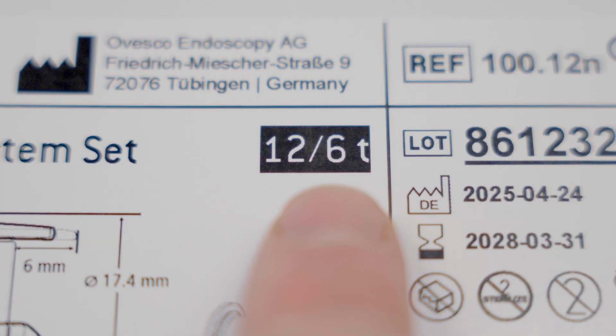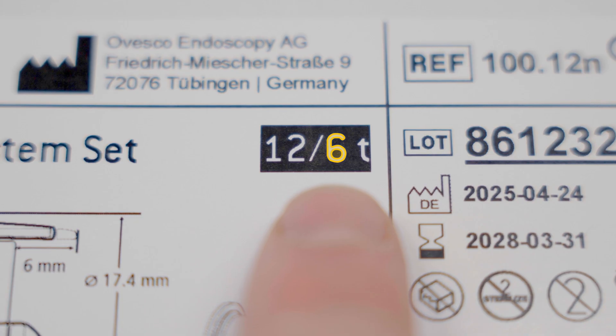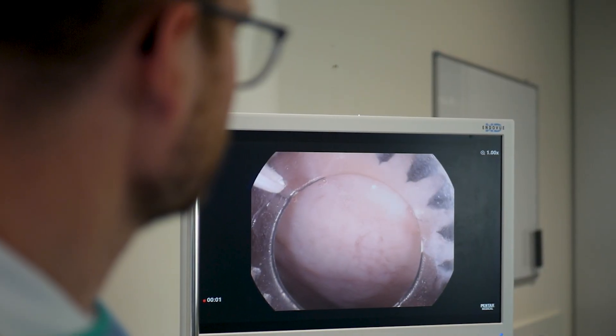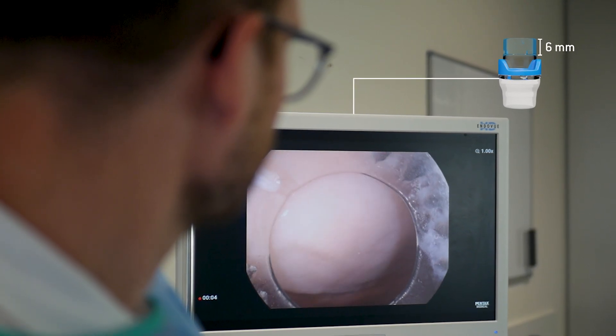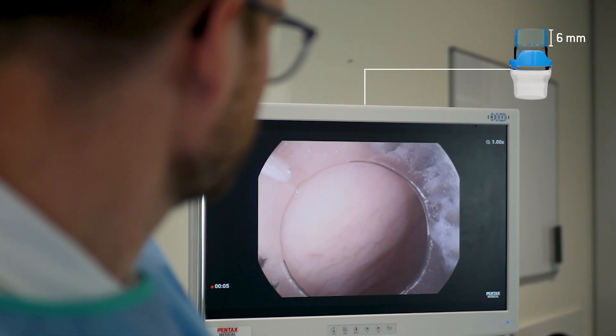The second number indicates the cap depth. The variant with a 6 mm cap depth allows the mobilization of a larger amount of tissue and is universally applicable, but may slightly restrict visibility.